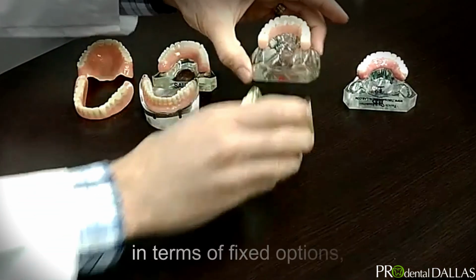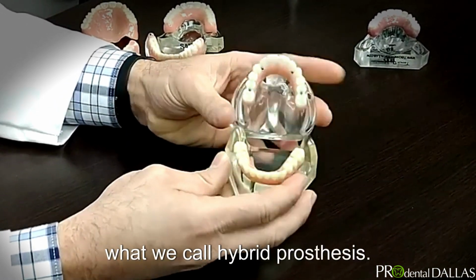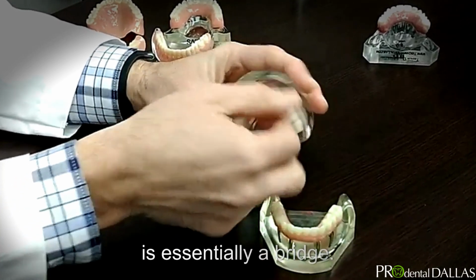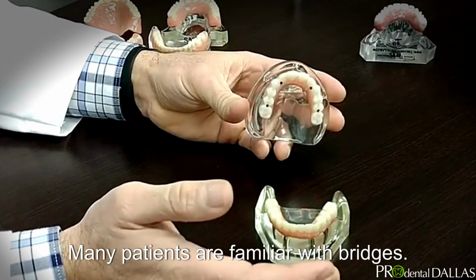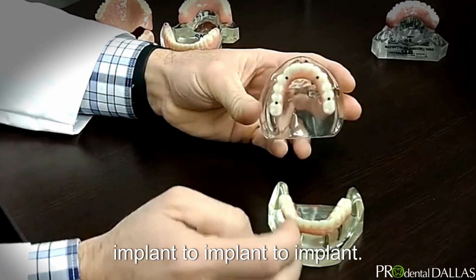Lastly, in terms of fixed options, you have what we call hybrid prostheses. And a hybrid gets its name because it is essentially a bridge. Many patients are familiar with bridges. They have a bridge from tooth to tooth. Well, this is a bridge from implant to implant to implant to implant.